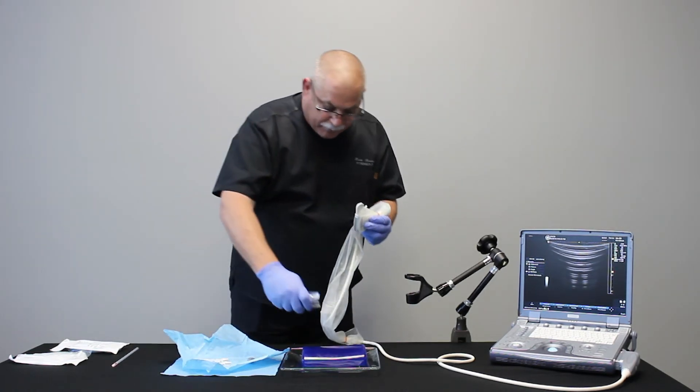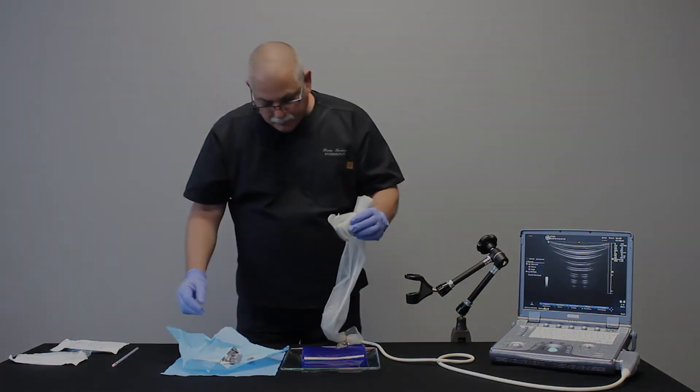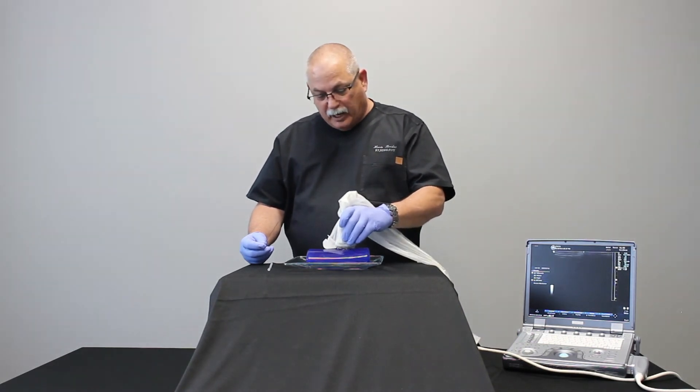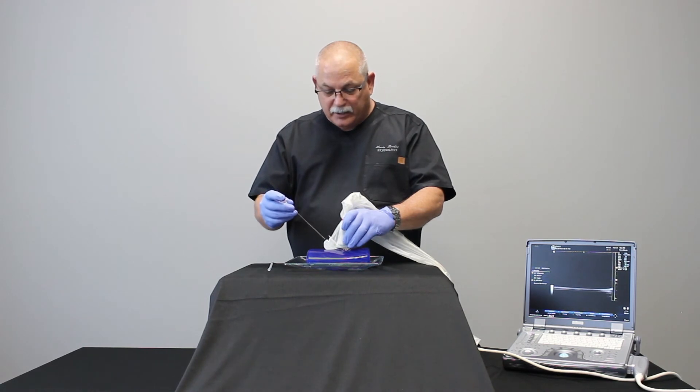Now I'll put a little bit of gel onto the phantom. Now that the guide is attached, we're ready to go to work. I'll demonstrate on this phantom — insert the needle into the channel.